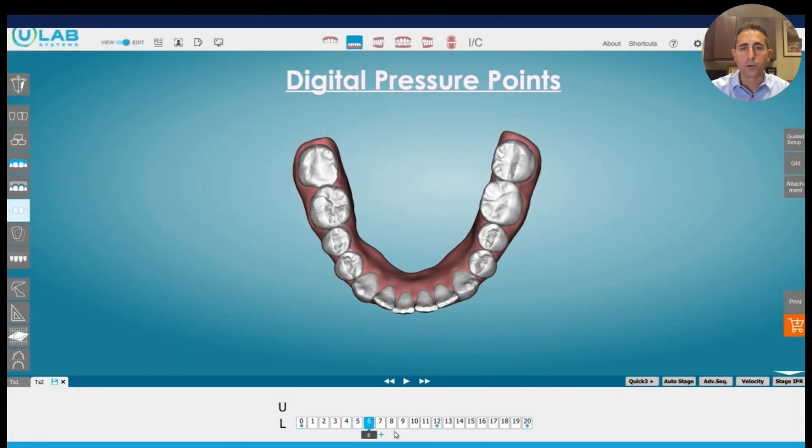Digital pressure points work in a very similar way. I use these more on the lower anterior than anything. So let's say our initial setup was just like it was at number 12, and we programmed the teeth to be straight. These are kind of extreme examples, but let's say the actual tooth looks like this — three of them straightened and one of them didn't. So we set up the case perfectly, but there's one tooth that didn't track.